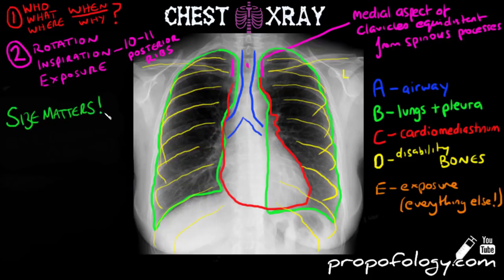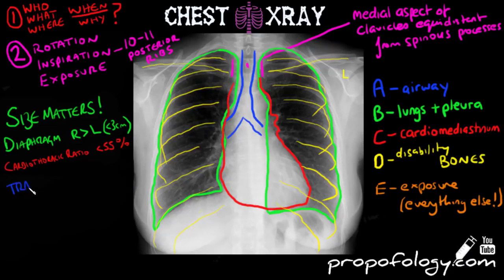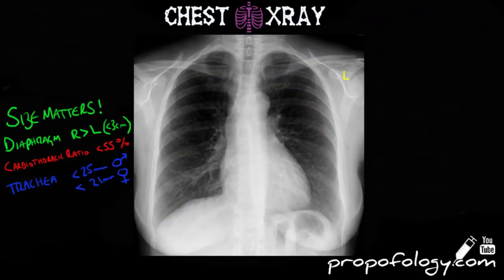Now that we've had a quick run around of the x-ray, we're going to start comparing sizes of different anatomical structures. In the diaphragm, the right diaphragm should be higher than the left, but no more than three centimeters. In terms of the heart, the cardiothoracic ratio should be less than 55% — meaning the heart should fill no more than 55% of the thoracic cavity.